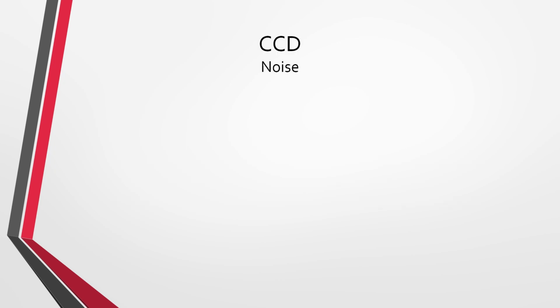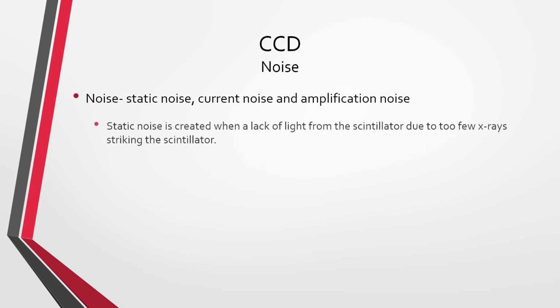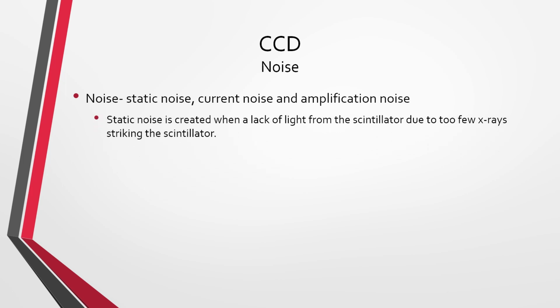Let's talk about noise with CCDs though. There are some disadvantages with CCDs, and that's the noise: static noise, current noise, and amplification noise. Static noise is created by a lack of light from the scintillator due to too few X-rays striking the scintillator. This is when you don't use enough technique, or there's some other thing in the way.